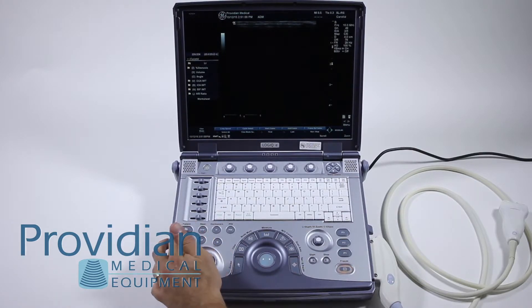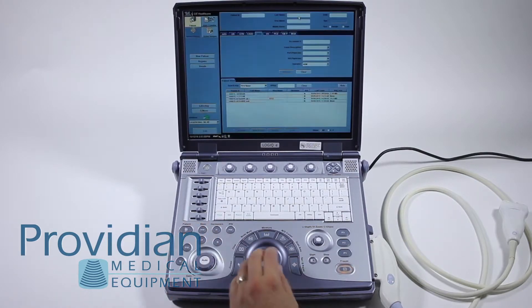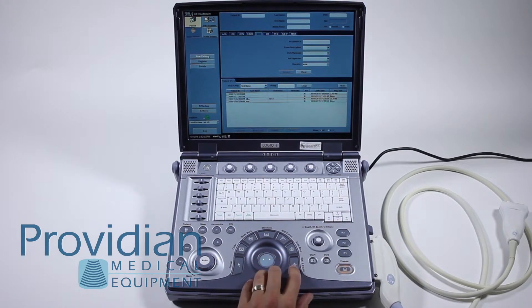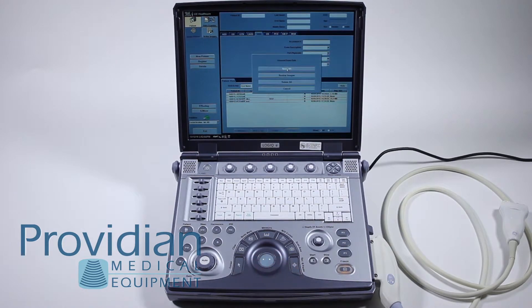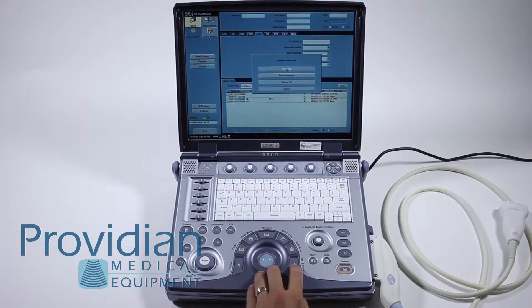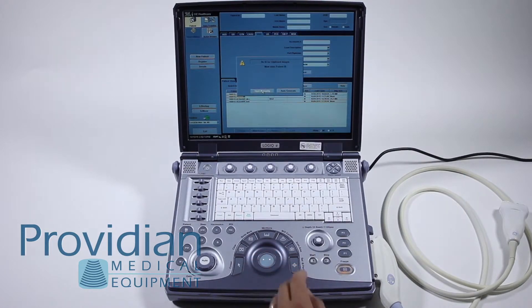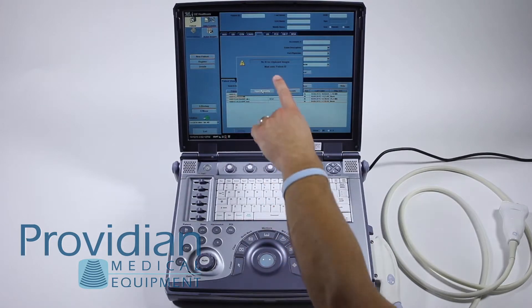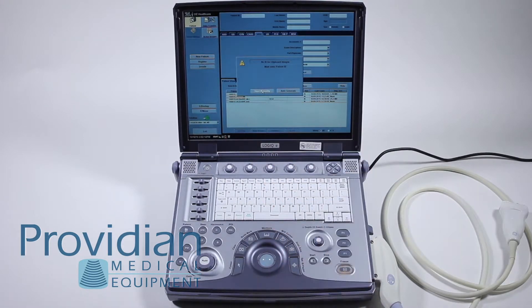We'll start by clicking the patient key and I'm going to click new patient right here. Now it's saving unsaved exam data — it's asking what I want to do: review the images, delete them, or store them. I'm going to go ahead and store them all. It's saying there's no ID for clipboard images.